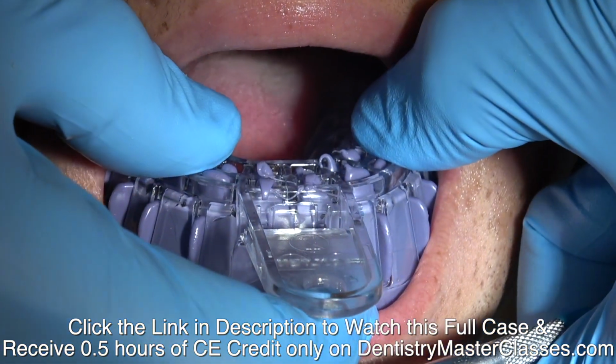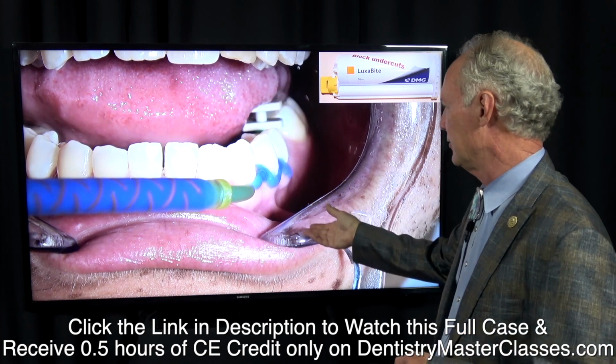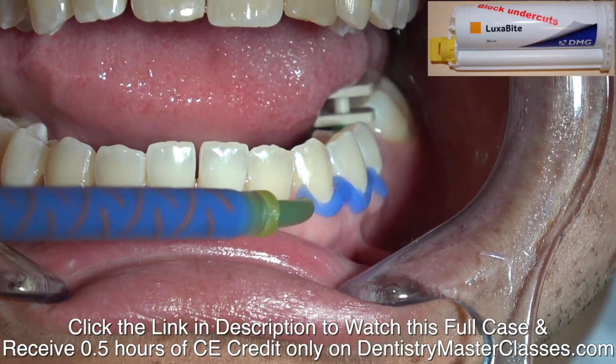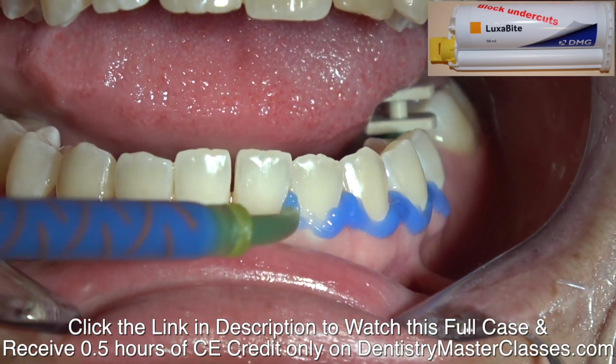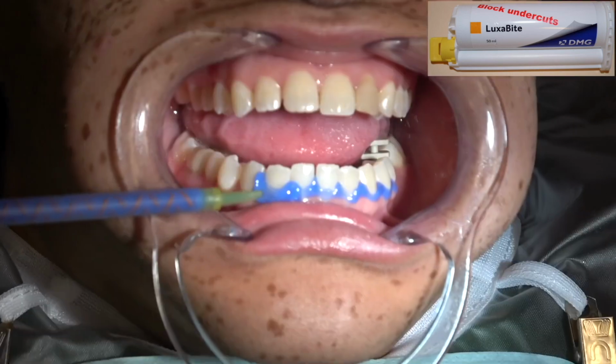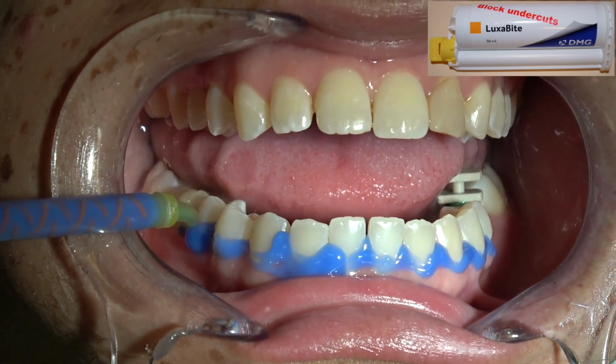This is a polyether with a custom tray. Very important you use a custom tray with polyether. If there's any question about the seating of the impression coping, take a radiograph, but you can feel it just snap into place, and then it's stable. If it hadn't snapped into place, you'd be able to move it. You know, it's very accurate.